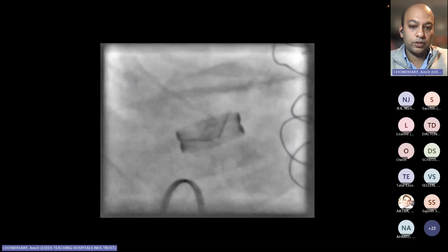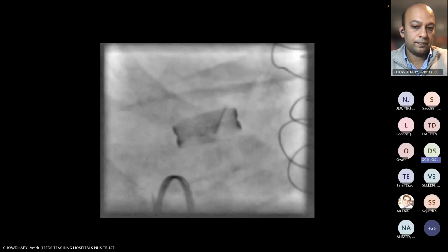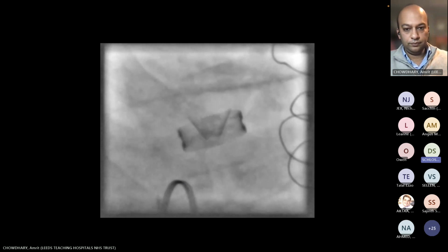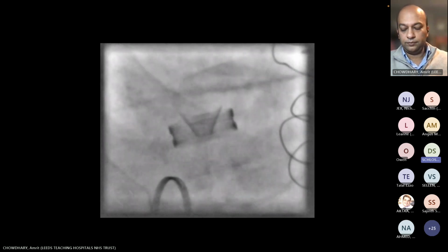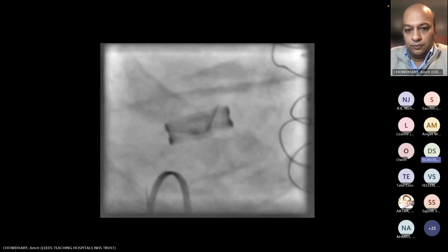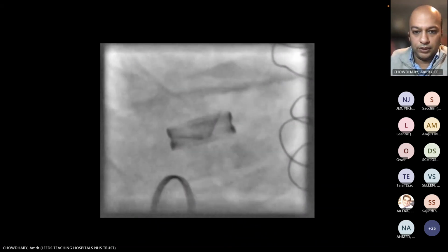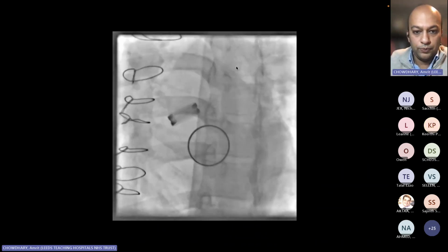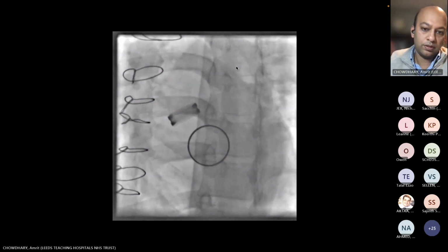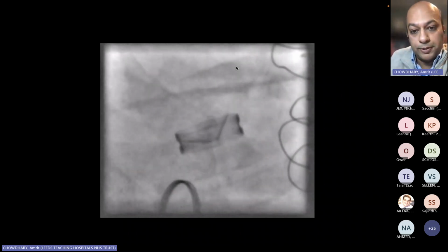And we move on to the next one. So this is the aortic valve. I think it highlights nicely how, depending on the view, you can't always see the other valve. So you really have to pay attention, because you can clearly see the valve there now, but it's really important to get the right angle. Yeah. So this was the other view. This is the view of the aortic valve.